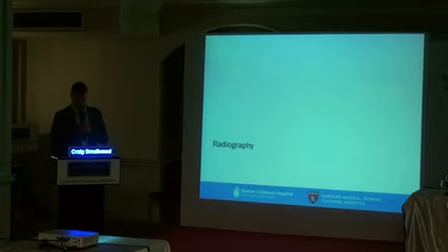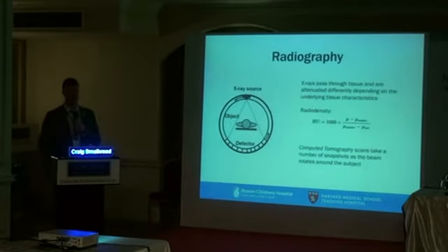So before we get into EIT, I want to talk about radiography. You look at these images every day and are experts, but I just wanted to review the methodology to make sure that the way we're getting images with the EIT device isn't that much different from a CT scanner. So this is a little picture of what a CT scanner looks like.